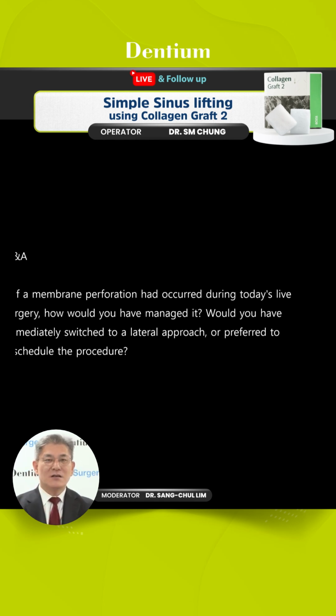However, with a higher artery course, it is simpler, safer and easier to make a lateral window and use the lateral approach. So depending on all the different situations, you have to decide: go to the lateral approach, or wait and try again with the crestal approach, I think 4 or 5 months later, right? That is my answer to your question.